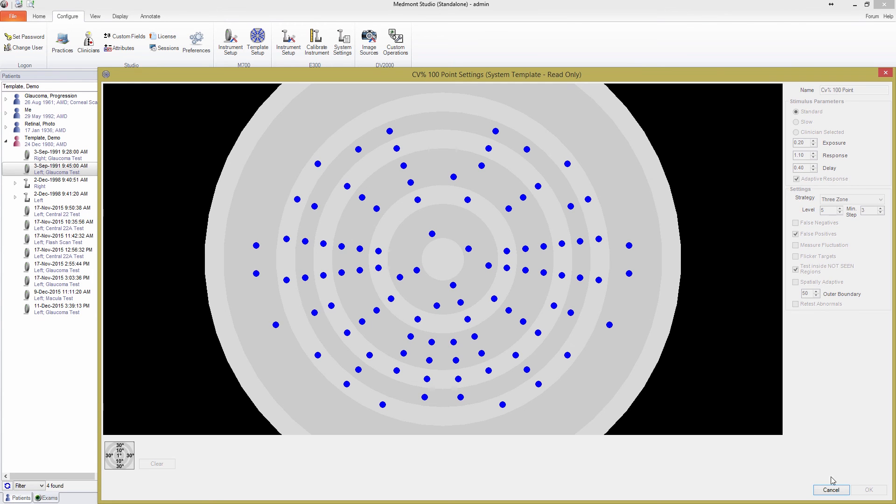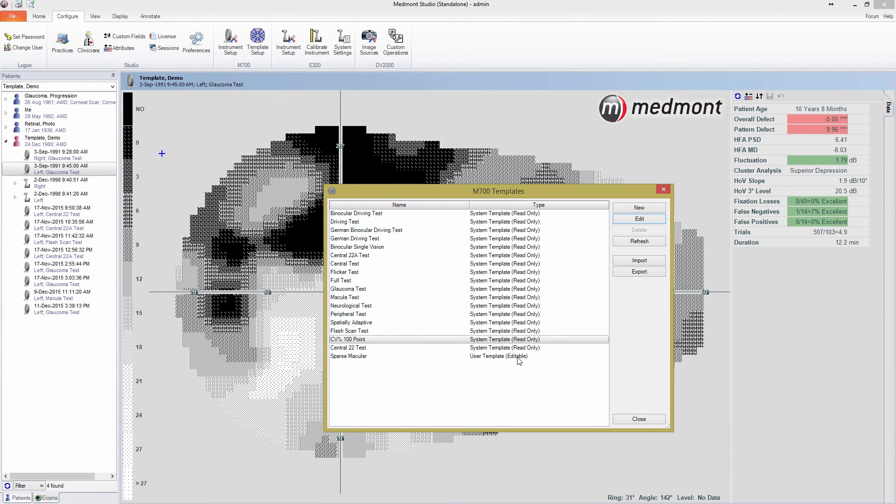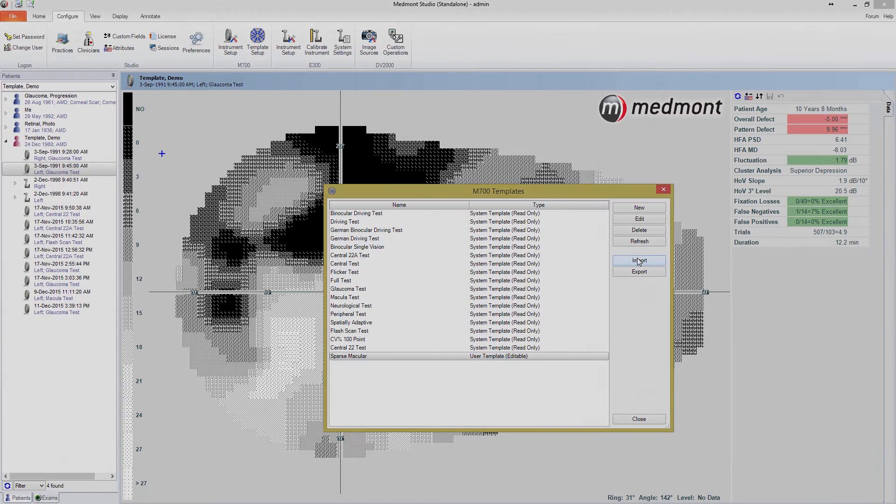Finally, from this window, you can import new templates, and export your old templates to share between practices. To find out more, take a look at the user manual.